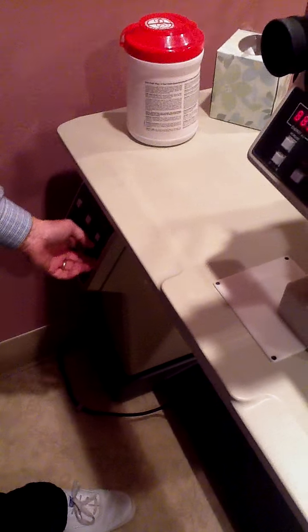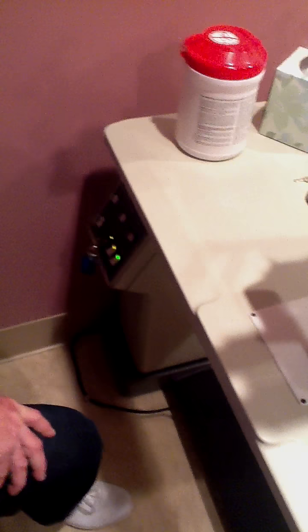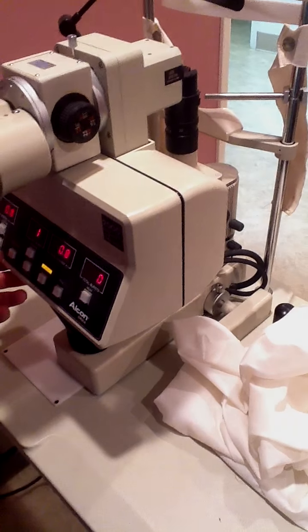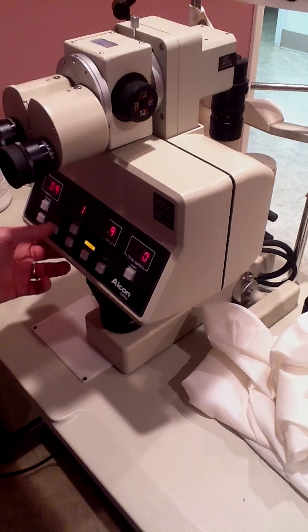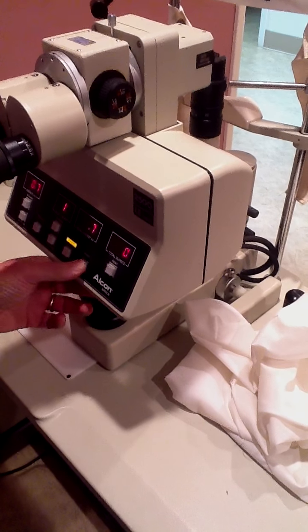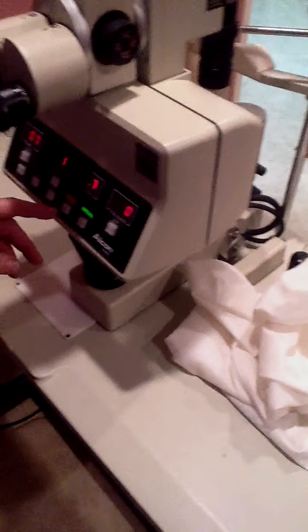Now these two buttons — one turns on the slit lamp, the other one powers the laser — so we flip those two buttons up. This is the up-down on the console. Now we're ready to begin the test firing procedure. Keep pressing this. Now that signifies that it's ready — the green ready button lights up.